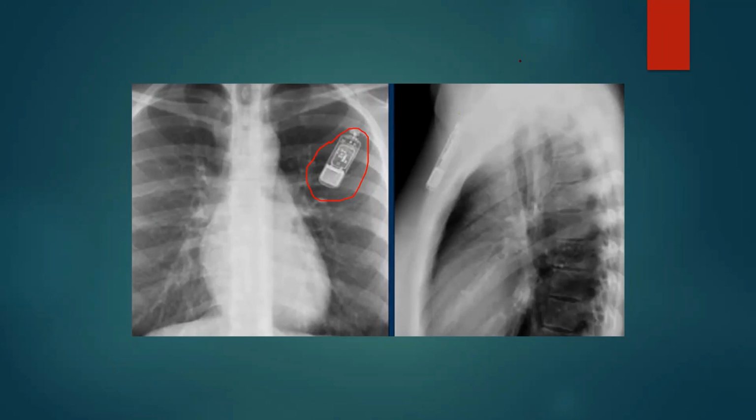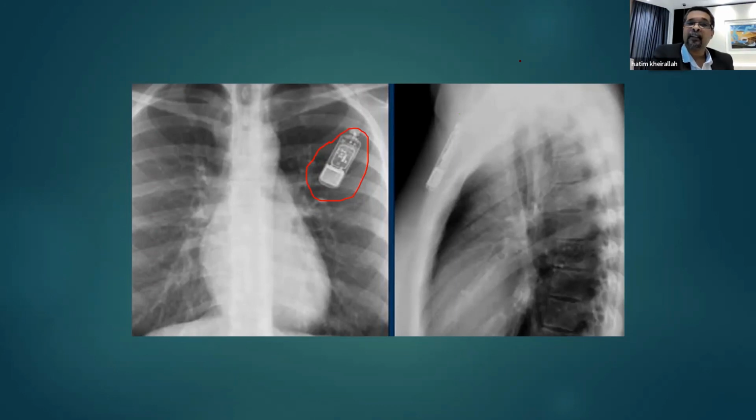When you do that, the signal is going to be picked up by the Reveal device, and it's going to freeze the recording before, during, and a few minutes after the patient presses on the button. That is going to be stored in the memory unerasably until you come and check on the device. But otherwise, if you don't press, it keeps recording and erasing, recording and erasing.